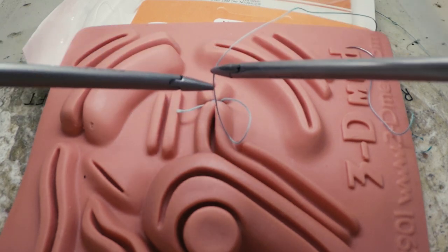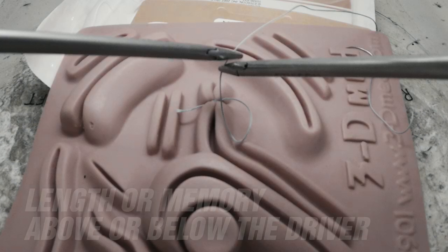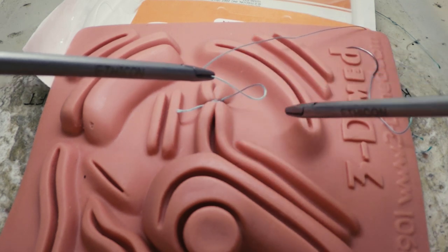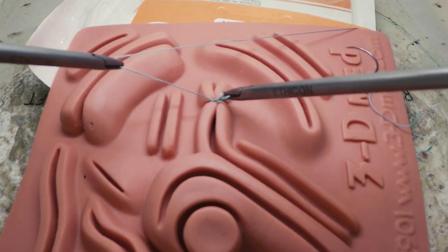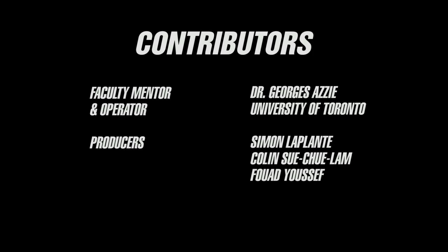Each time you re-grasp the suture to change hands, make a conscious decision to either grasp it on the knot side of the driver to shorten your loop or on the needle side of the driver to lengthen it. A short loop facilitates snugging down the knot in one motion rather than multiple. Square knots require that you snug your knot down in the tissue plane parallel to the axis opposite of the knot.